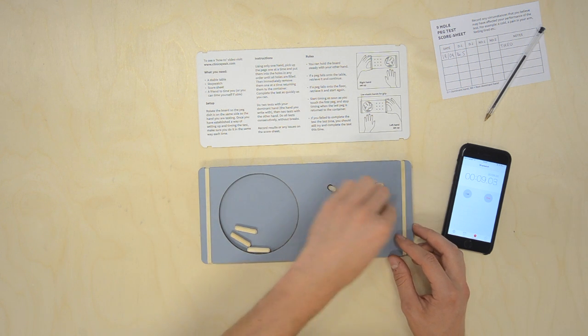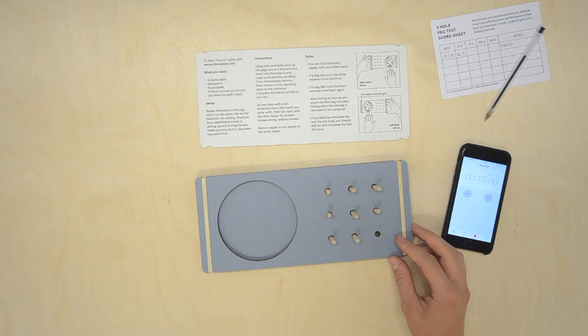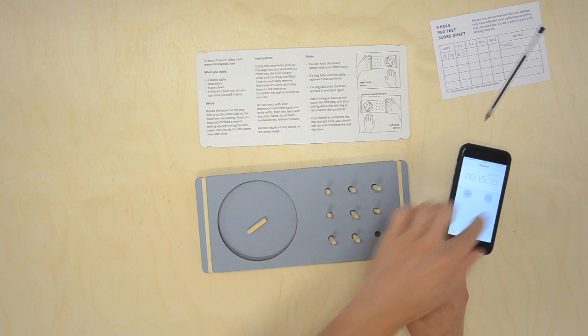If a peg falls onto the table, retrieve it and continue. If a peg falls onto the floor, retrieve it and start again.